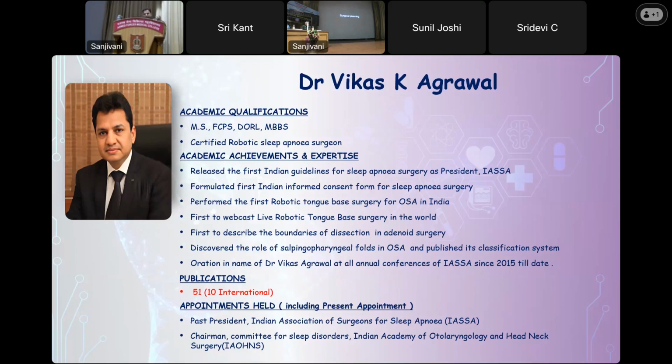Surgical planning, obviously, navigation. So robots will work with navigation, which will work with the high-end CT scanners and MRIs. And the day is not far when actually robots will do the surgery.